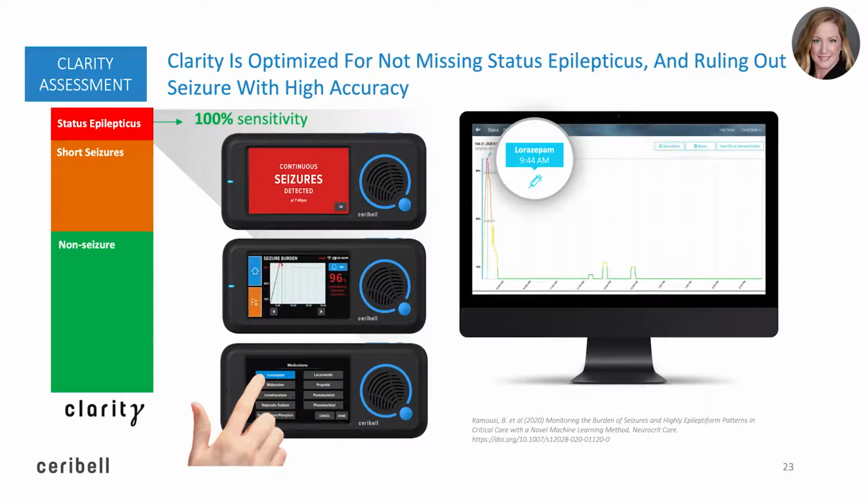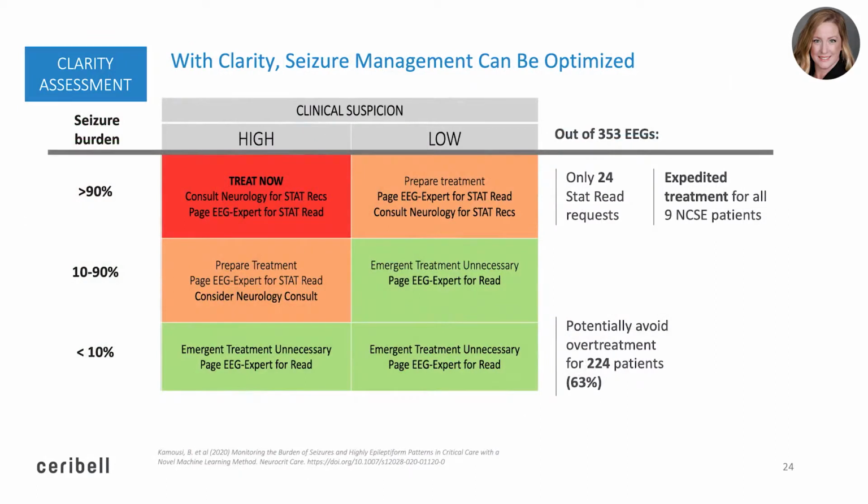There is not a camera on the device, and by flagging the medication, you are communicating with that team that an intervention was made. This can be performed by anyone on the team responding to the patient. No need to worry about the milligrams given or the exact time. Documenting in your EMR should take priority. The seizure burden is one data piece that goes into the decision-making process for our provider partners.